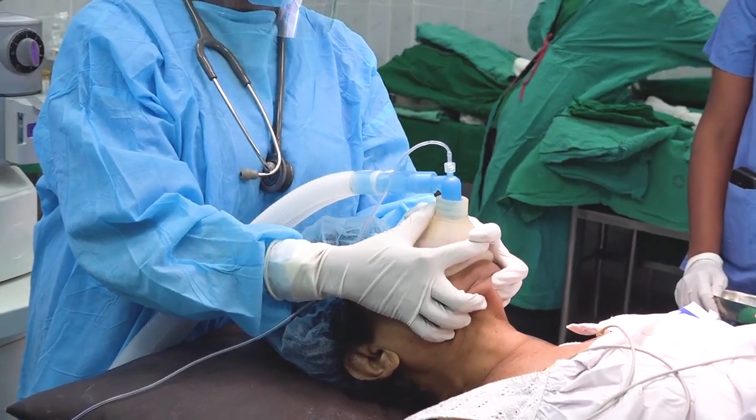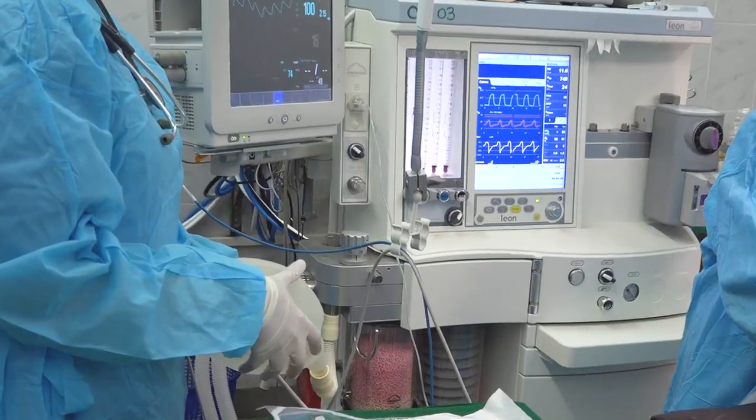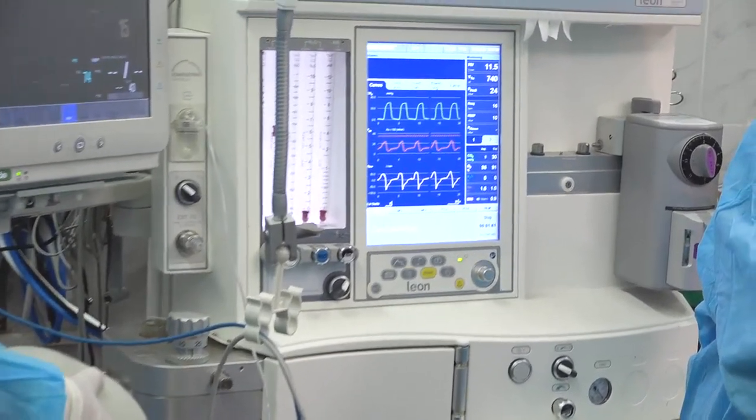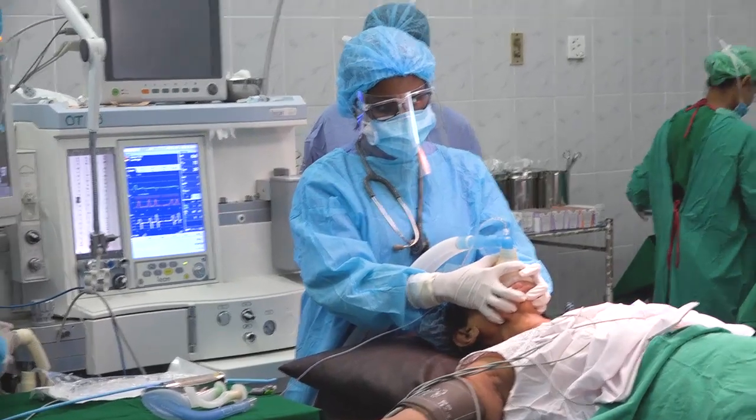And do not use nitrous oxide because you want to fill the functional residual capacity of the patient with 100% oxygen to increase the safety margin in case of a difficult intubation and a period of apnea.